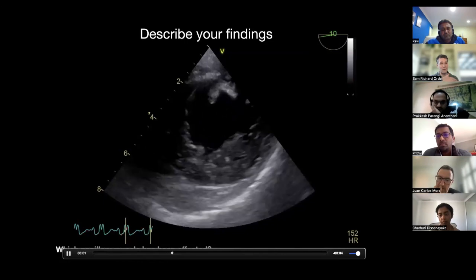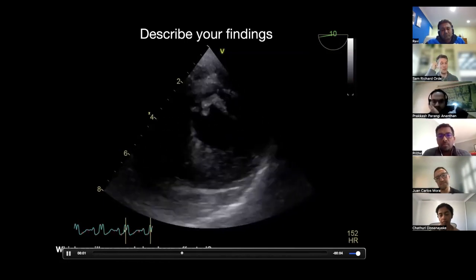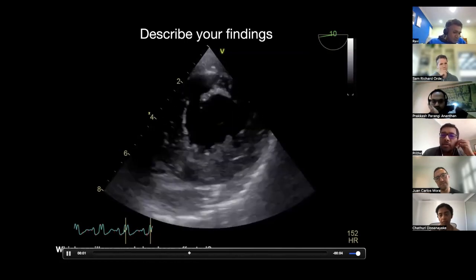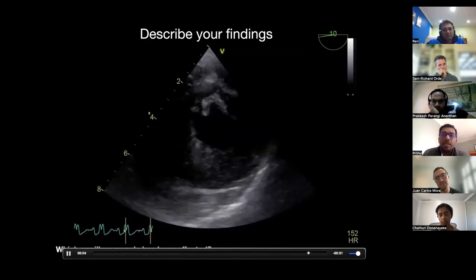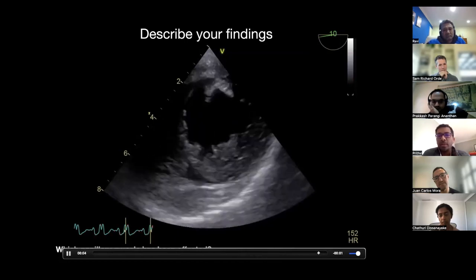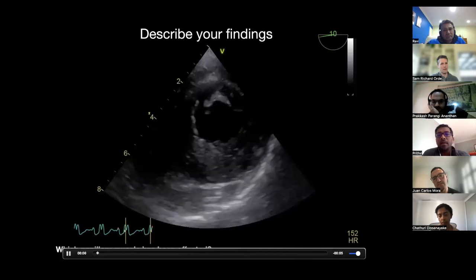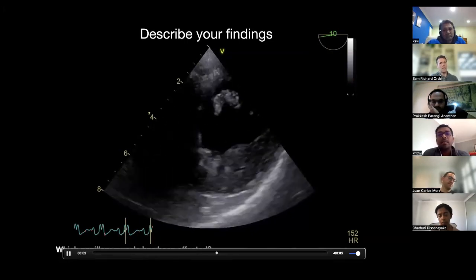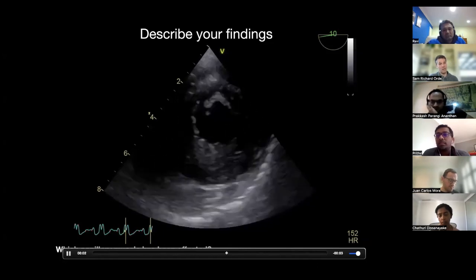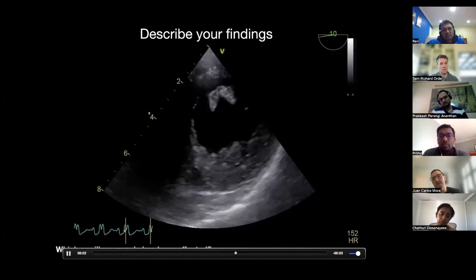And if you're getting a vibe that that's what this question might be about, go for it, because often you might not see left atrial enlargement. Yeah, acute MR occurs suddenly, so the LA is unprepared. Absolutely. It's not dilated, so there's going to be an acute increase in left atrial pressures and acute pulmonary edema. Very nice. The one that is often asked in the exam is the acute versus chronic with aortic regurgitation, of course, as well. So that works for that one as well.